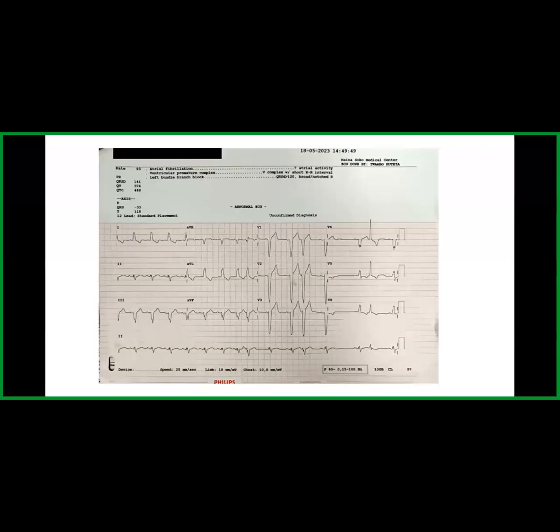So how would the ECG present? If we recall what a normal ECG looks like, just eyeballing this ECG here, we are able to tell that it is something quite different. As well, we can see some of the criteria that we talked about in the previous slide.